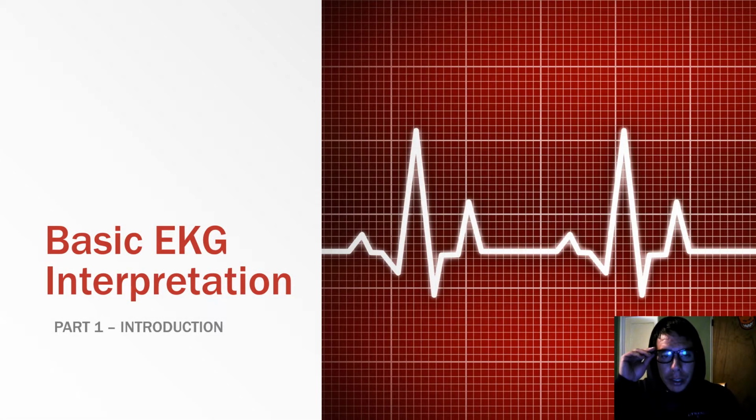Hello and welcome. In this video, it's going to be quite a video, but this is going to end up being several videos, this one probably being the longest, and we're going to go over basic EKG interpretation. Out there, there are classes that will get you a certification in basic EKG interpretation.